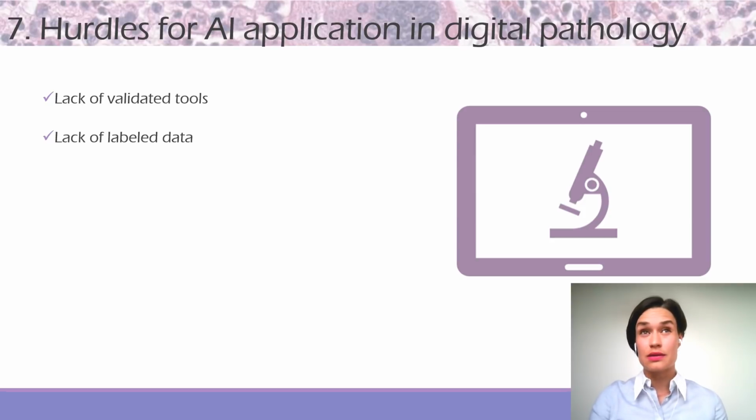We said that supervised machine learning needs a large amount of labeled data. This would mean that the pathologist, instead of looking at slides, would have to go and start annotating whatever structures they want to have detected, and it's not going to happen because they are supposed to diagnose patients and they use slides for that, the non-digitalized slides.